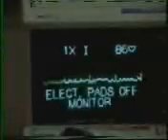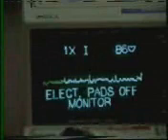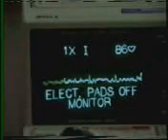Electro pads off or electrode short. This is displayed when the electrode contact is faulty. Check application of the stat pads to the patient and all connections. Select defib. This may be displayed when the Analyze button is pushed, but defibrillation is not the selected function. In this condition, move the dial from either monitor on or pacer on to defib on.